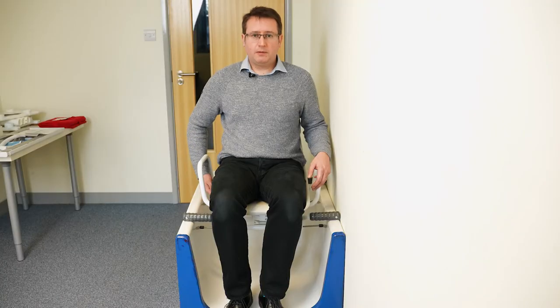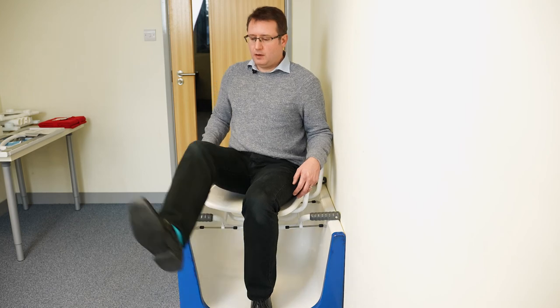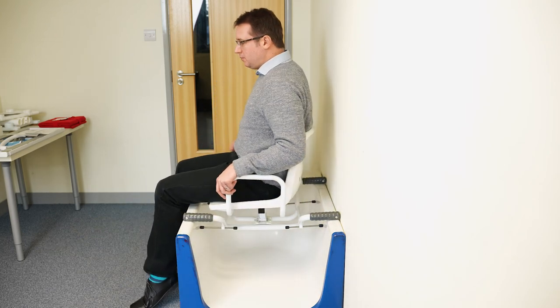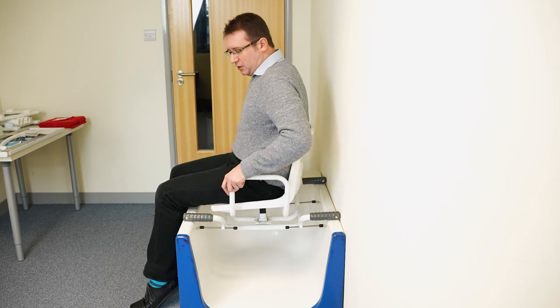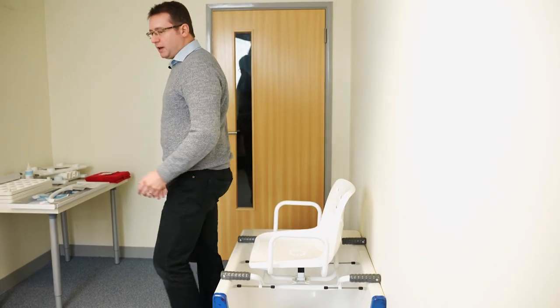When the client wants to come out of the bath again, lift the locking lever slightly to unlock it and turn, then lift the legs back over the side of the bath, rotate the swivel bather, and the locking lever will lock again in the outward position. You can then use the armrests to help push up from the side of the bath and get out.